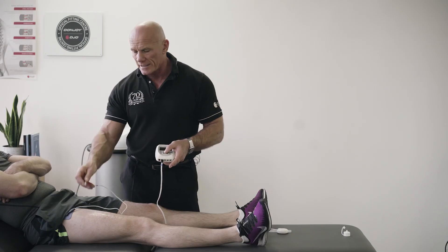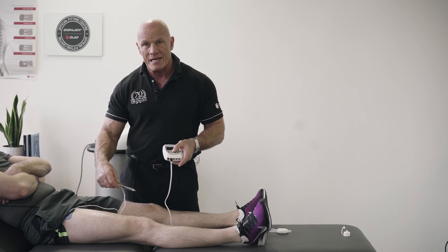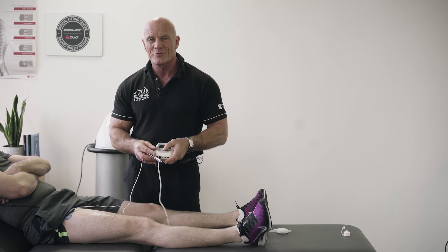On our Chattanooga Academy I can also show you how we can use this motor point pen as a diagnostic tool. We can actually determine whether we've got things like AMI — arthrogenic muscle inhibition — or any other pathology which affects the patency of a motor nerve. I hope you find that information useful and I look forward to chatting with you again.